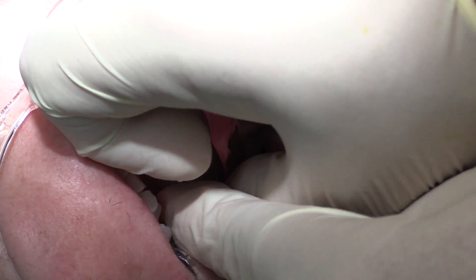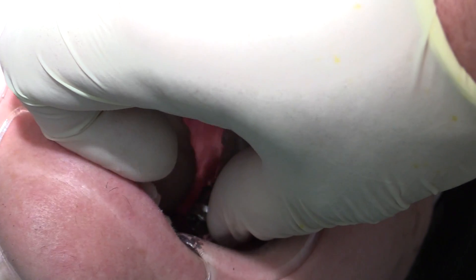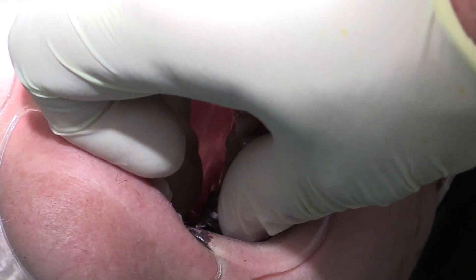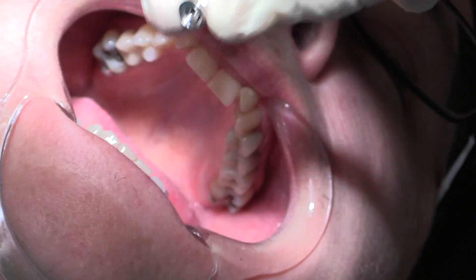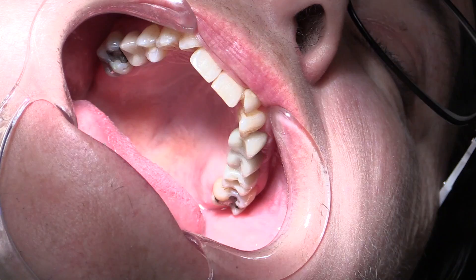As I take this I can carry the whole assembly to the back of the mouth quite easily. Ideally you should put a little bit of floss on this — it'll make your life easier. I just have the patient tipping their head a bit towards me so the screwdriver is not going to fall out. We put this in and you can test the bite at this time, but I like to take an x-ray first, so I lightly screw it down and take the x-ray.